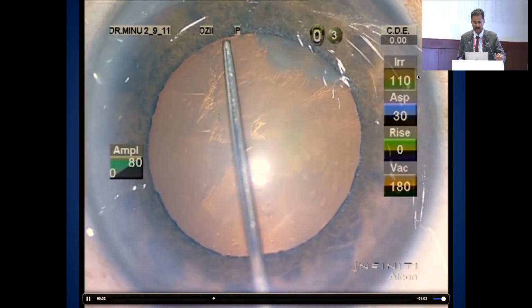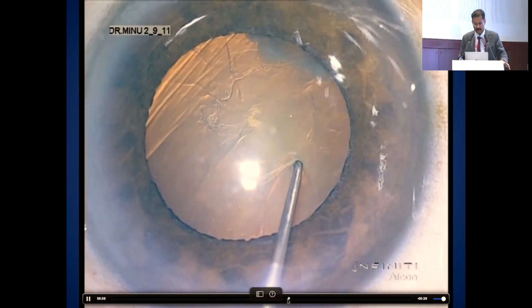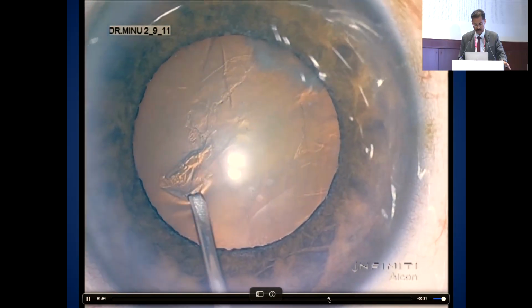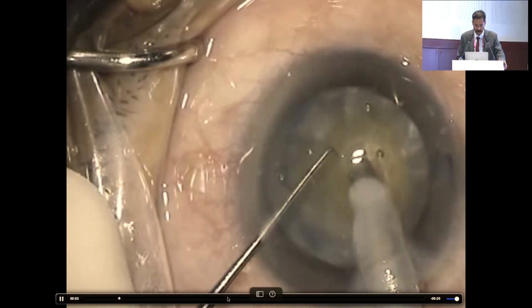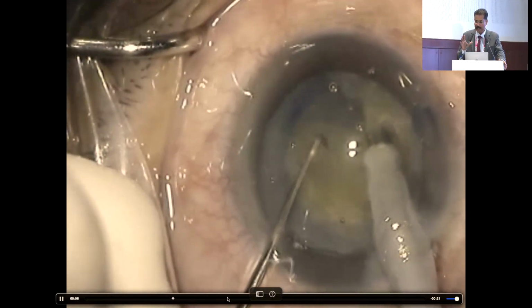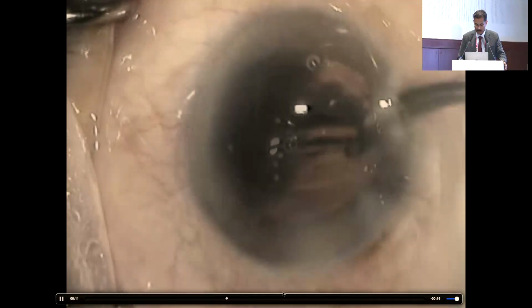You don't have to. This is just for demonstration's sake. I am trying to bunch it up and take it up. Beyond that, you can see the whole thing is being bunched up now, and then the capsulorhexis is started separately on the capsule and finished. So just to show you that even if you think that your manual rhexis is quite good, be gentle with your anterior capsule and your rhexis margins. Otherwise, see the rhexis margin is complete here.